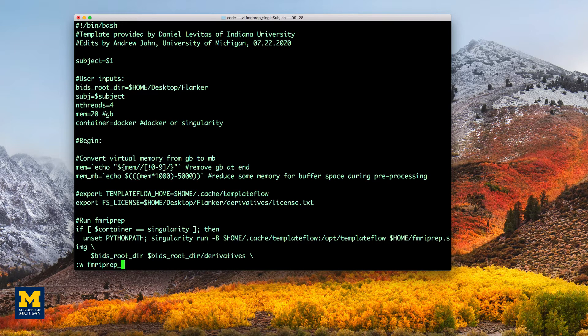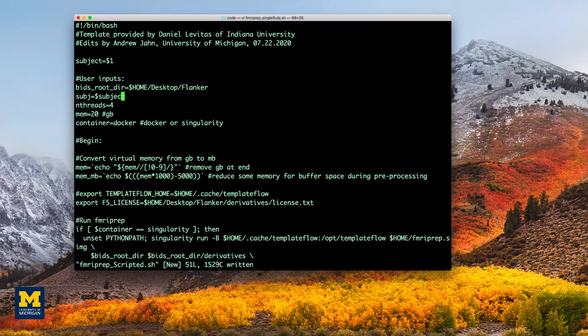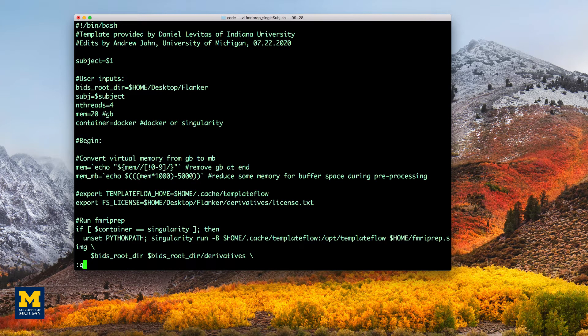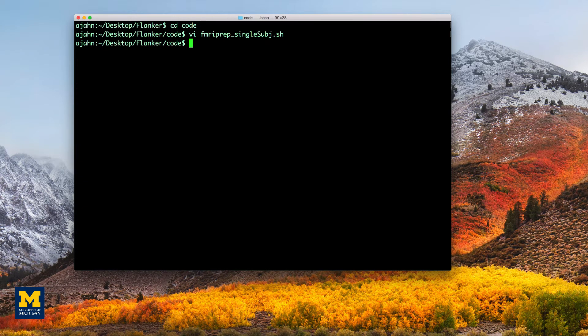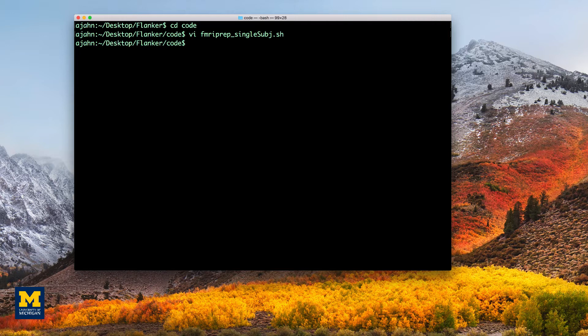And I'm going to write this file as fMRI prep underscore scripted. You can make the changes yourself, as I just did here, or you can download the script from the link in the box down below.